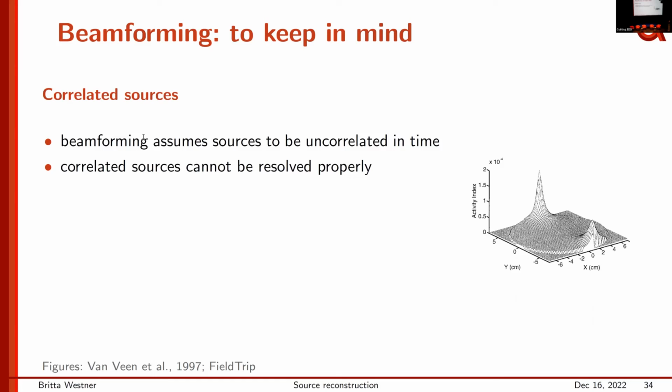You would also go over the whole head, maybe down your nose, which you then later in co-registration towards the MRI can use for an automatic fitting of those points towards the MRI, which makes that part more realistic.